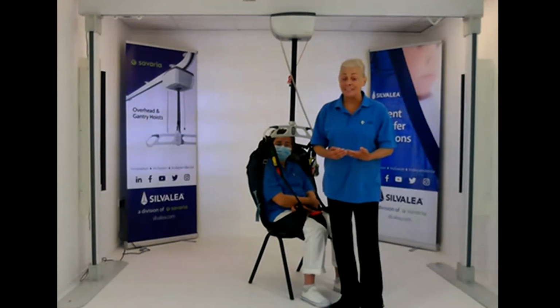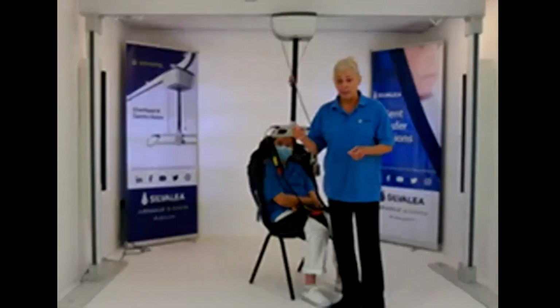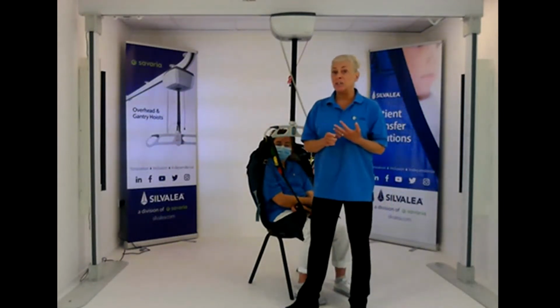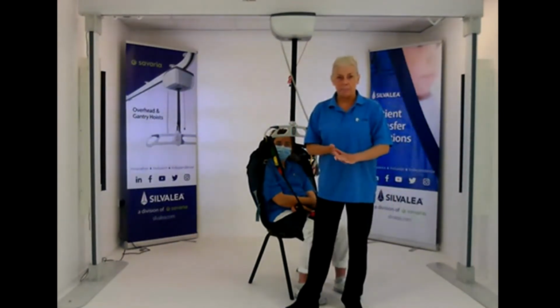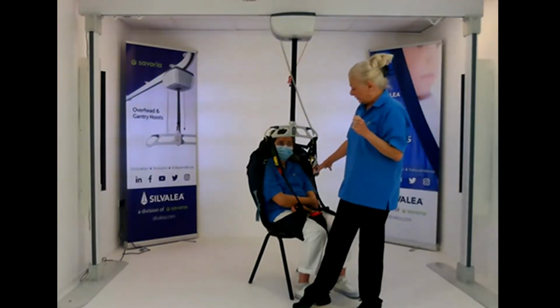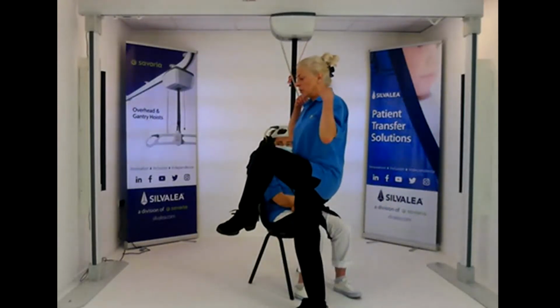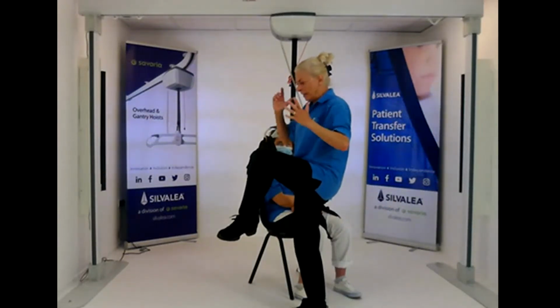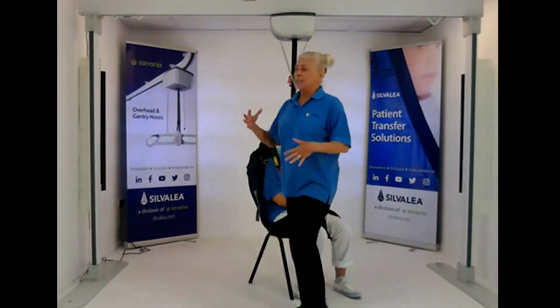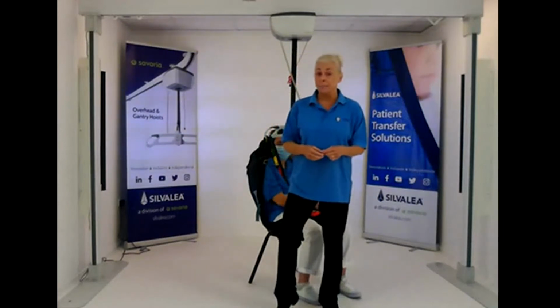When someone is that determined, it's going to be tricky. But we do have a sling I will show you in a minute, I think that's the penultimate one, the Tinkham. Our Tinkham sling, which is really all singing, all dancing. That may give you some idea of what that will do. But certainly the deluxe will help. You've got to try and break up the extension, and often you need to keep the legs short, shoulders protracted. Maybe the neck roll will help. Keep them fixed in that position to help prevent them twisting and falling. We can try, but as I said, if they're that determined, it's going to be tricky.